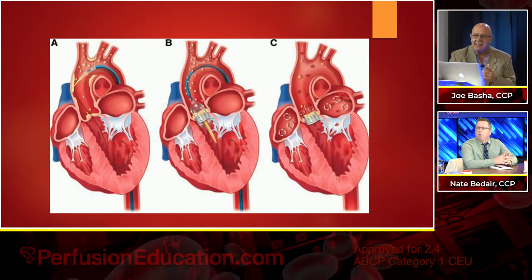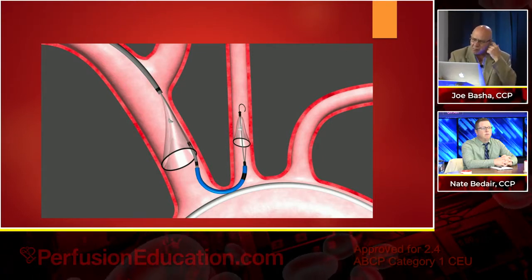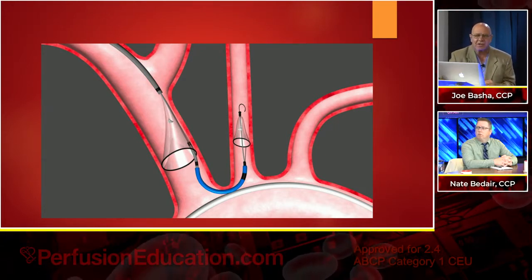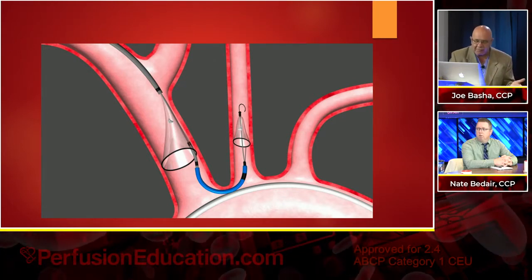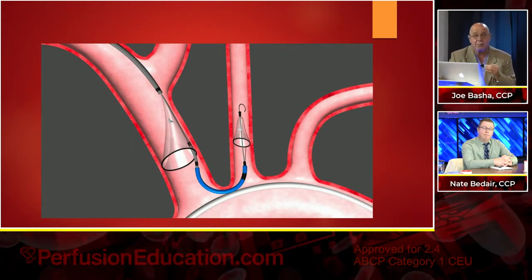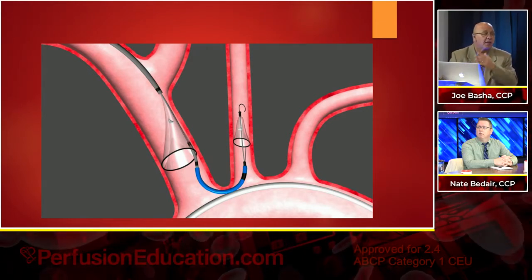What effect did that have? Now, you have this device. This is the Sentinel device. It's put in through the axillary artery, and one stays in the innominate and the other one goes up into the left carotid. And what that does is actually captures any embolic material that goes up. Now, the limitation of it is there's nothing in the left subclavian, and of course the vertebral comes off the left subclavian, so you still have some risk. You also have risk putting it in, because you will also have a shower of some embolic material. But will it be the same load as it would be putting that big TAVR in?